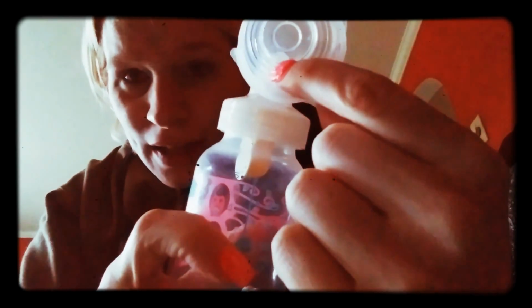Goes on like this. So the bottle is going to attach to this part, and the tubing will go into this hole. It's very hard to see, and it will make the air go in and out. But this part right here goes into here. So this is actually one of the best setups I have to be able to make a pumping bra, because I can just slide this in here.